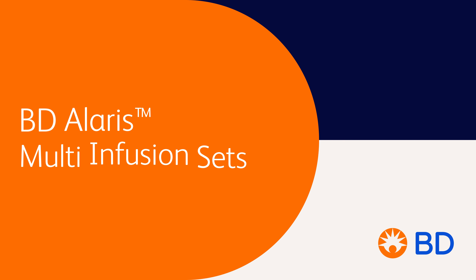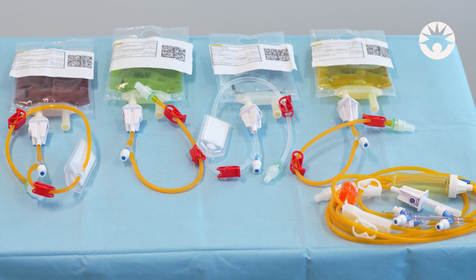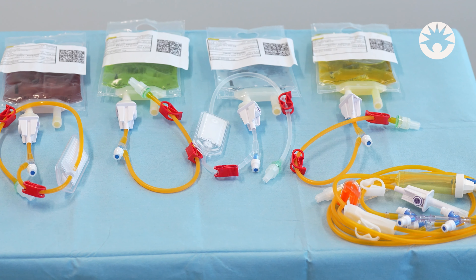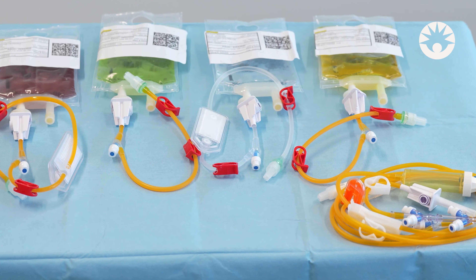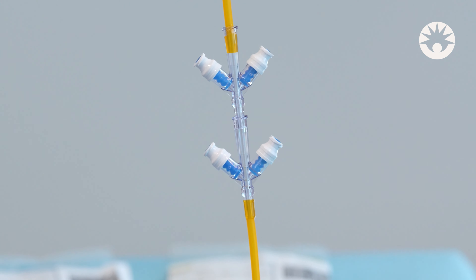BD multi-infusion sets allow the administration of multiple drugs through the primary administration line. The multi-infusion set, also known as the Quattro system, allows the connection of up to four secondary infusions through the BD SmartSight needle-free accesses in the upper part of the set.